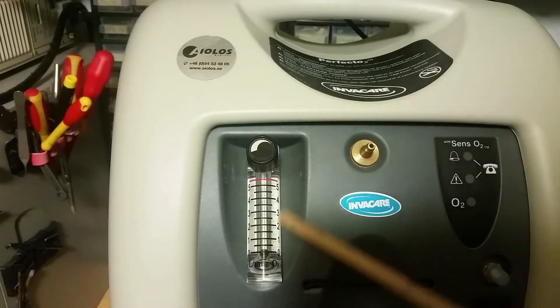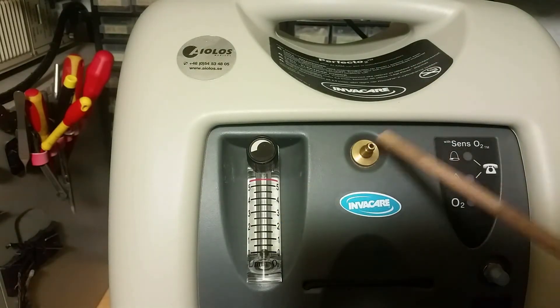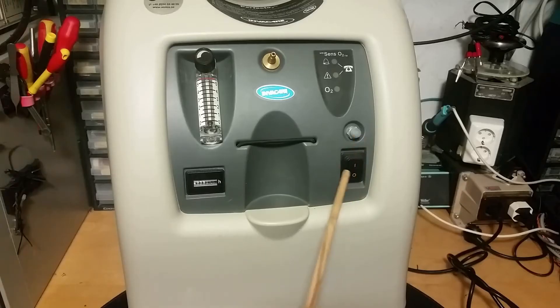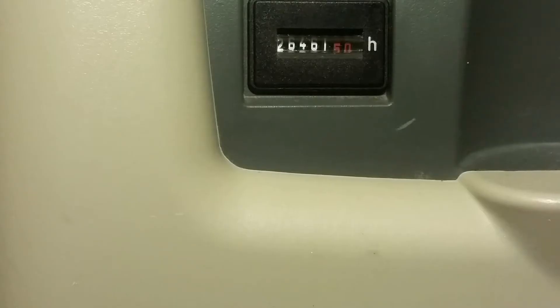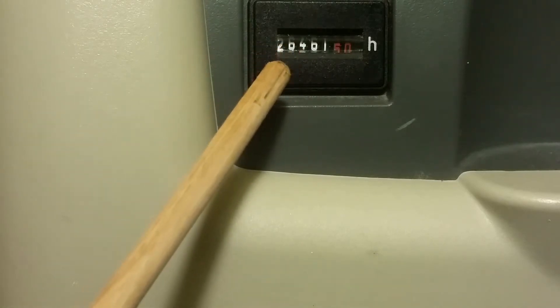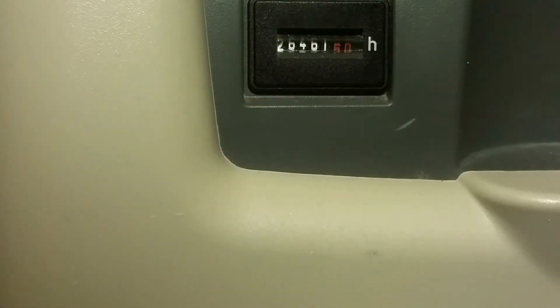We got this flow meter here, output, and some alarms — this one for low oxygen. We got the light with the on/off switch and a display showing how many hours it has been running. Here you can put a bottle with water to humidify the outgoing oxygen.